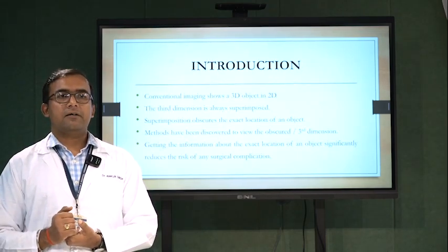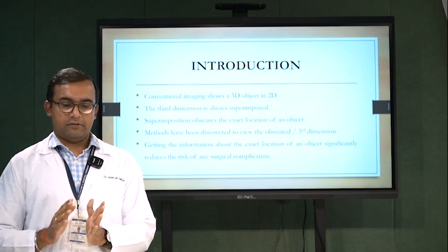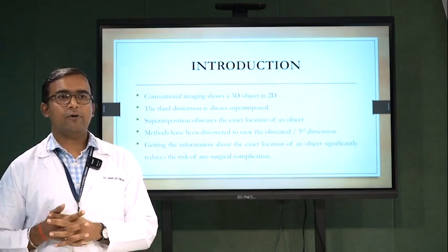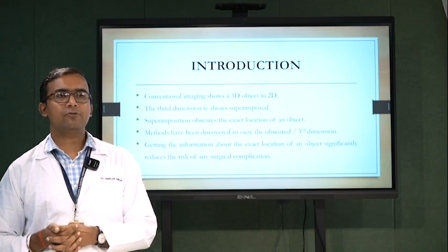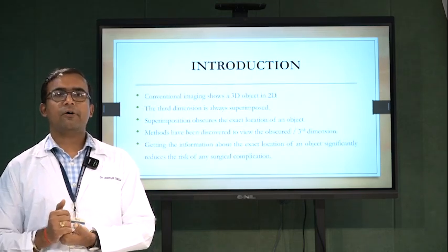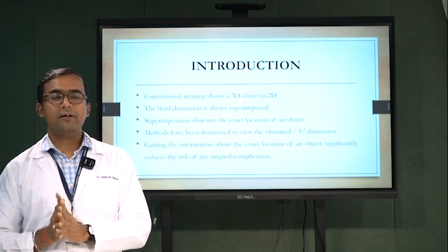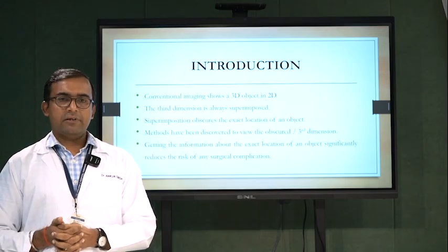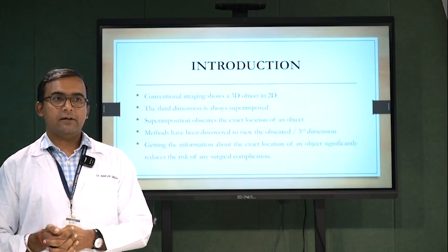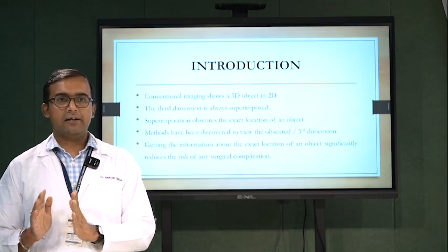So that creates trouble whenever we try to operate or surgically extract a tooth or the object or a foreign material or a fractured tooth if we want to oppose it. So the third dimension is important. So in order to reveal the obscured third dimension, this technique is used.